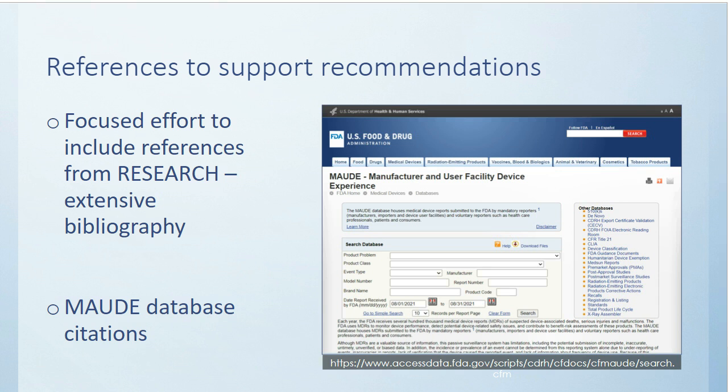It may be eye-opening to you to see things like not only these serious infection outbreaks and cross-contaminations, but instances of devices that are significantly damaged, that the facility wasn't inspecting, and they were used on a patient, and then the patient got harmed, significantly injured during the procedure because a malfunctioning or damaged endoscope was used on them. So that's all there for your publicly available information to review. So take advantage of that.